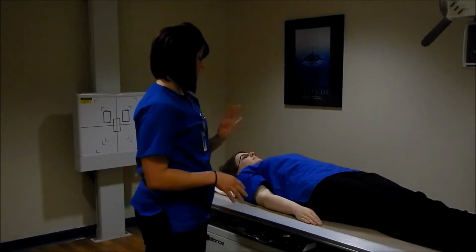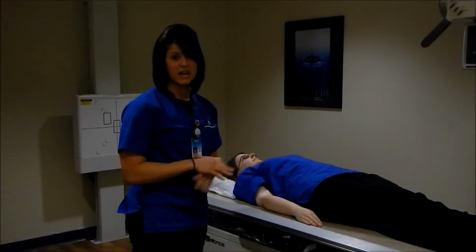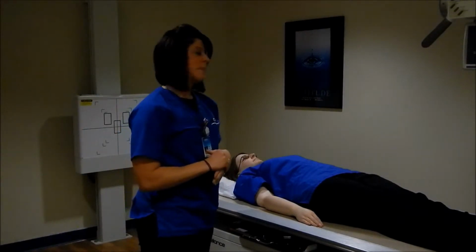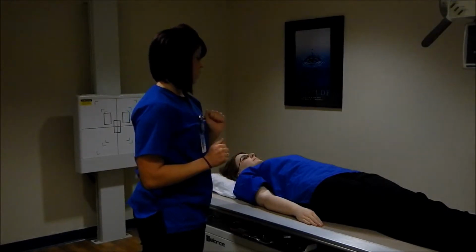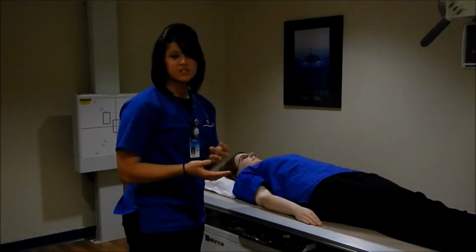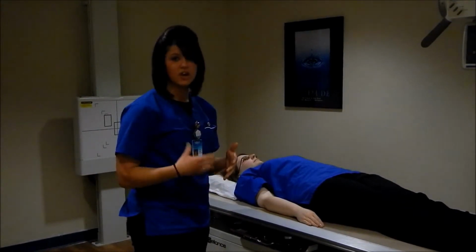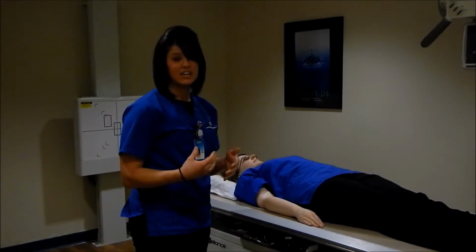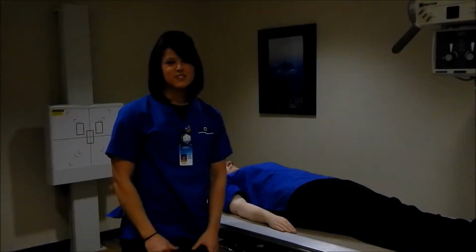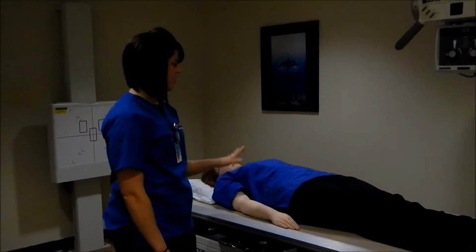The next thing is to make sure they're not pregnant, so we're going to ask about pregnancy and their last menstrual period. Then I'm going to get the signs and symptoms. We're going to ask questions such as if they're having any abdominal pain, nausea, vomiting, diarrhea, constipation, or if they've had any surgeries. Once you've covered all of that and have your patient in the gown, you're going to have your patient get on the table.